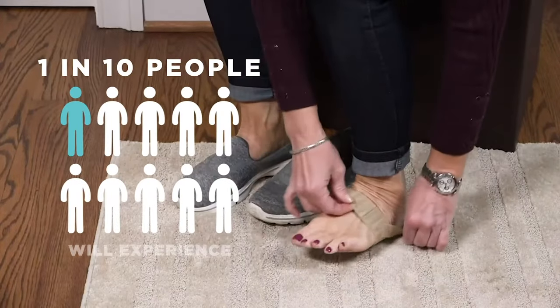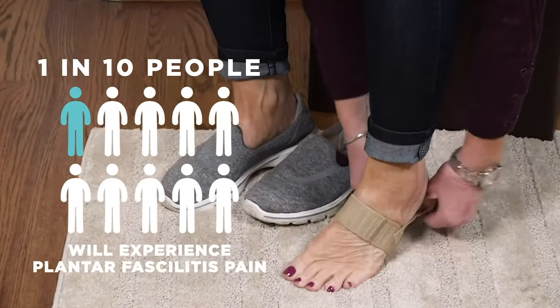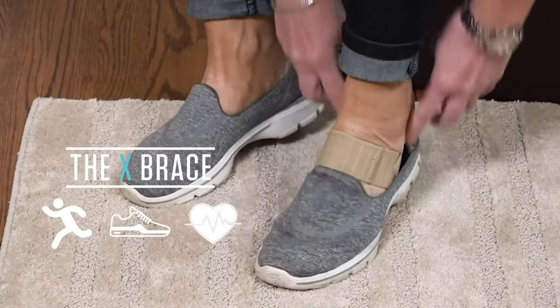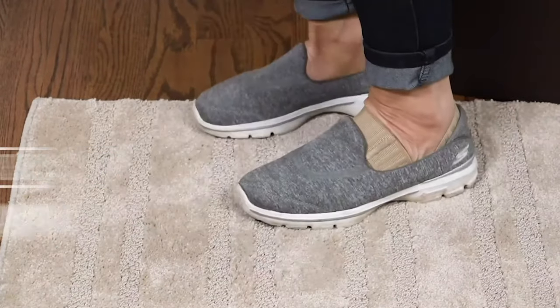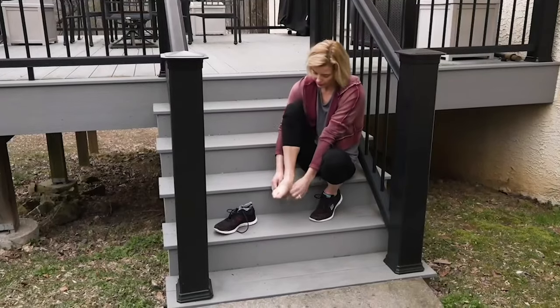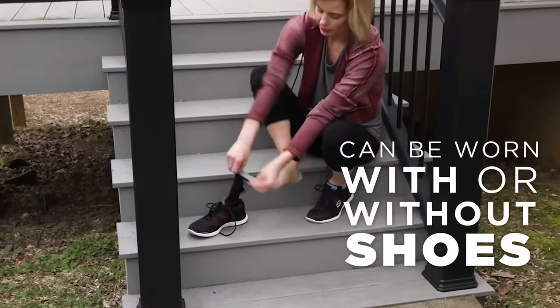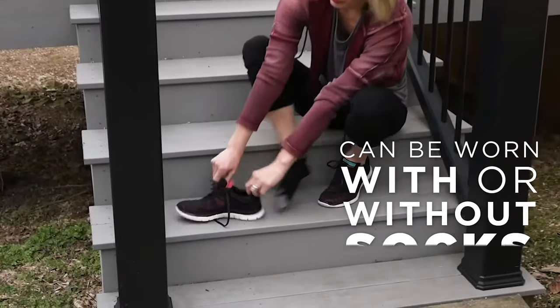One in ten people will experience plantar fasciitis pain, and the X-Brace fits any activity, any shoe, and all lifestyles, supporting your arch, cushioning your heel, and relieving your pain. It can be worn with and without shoes, and even with and without socks.